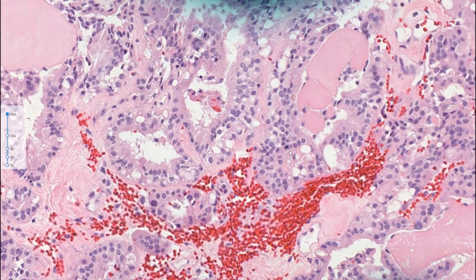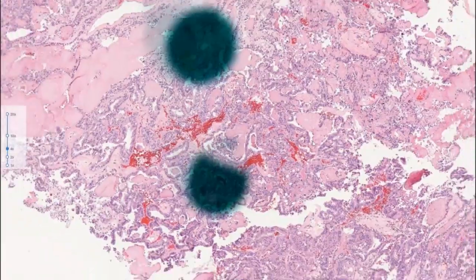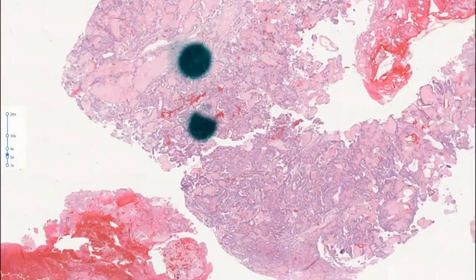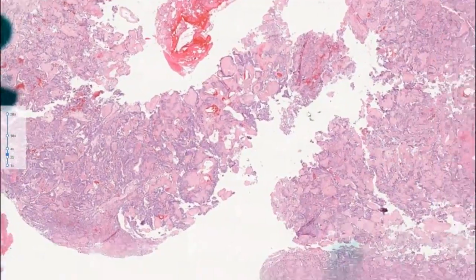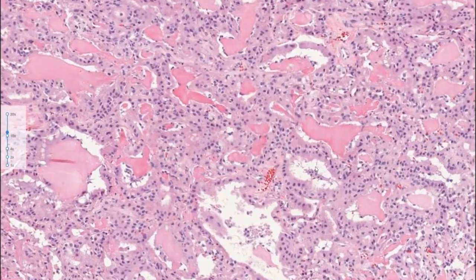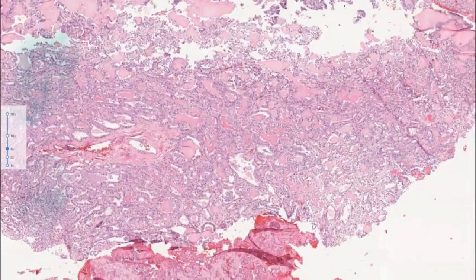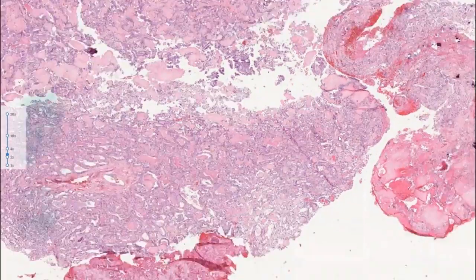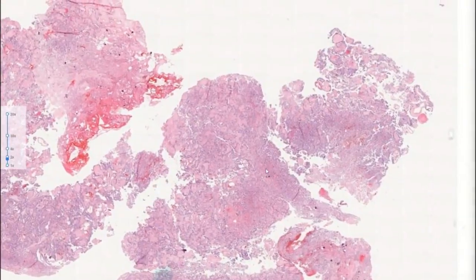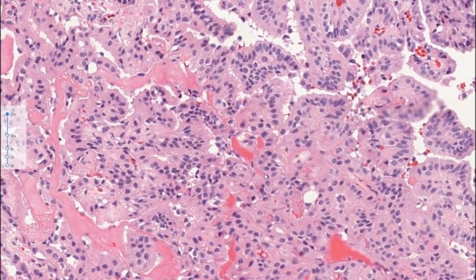Another one here. So in this case, compared with the other ones, we do see some increased proliferation. Not much atypia. There is sufficient atypia to be able to recognize it as neoplastic choroid plexus, or choroid plexus neoplasm, but not the most striking.